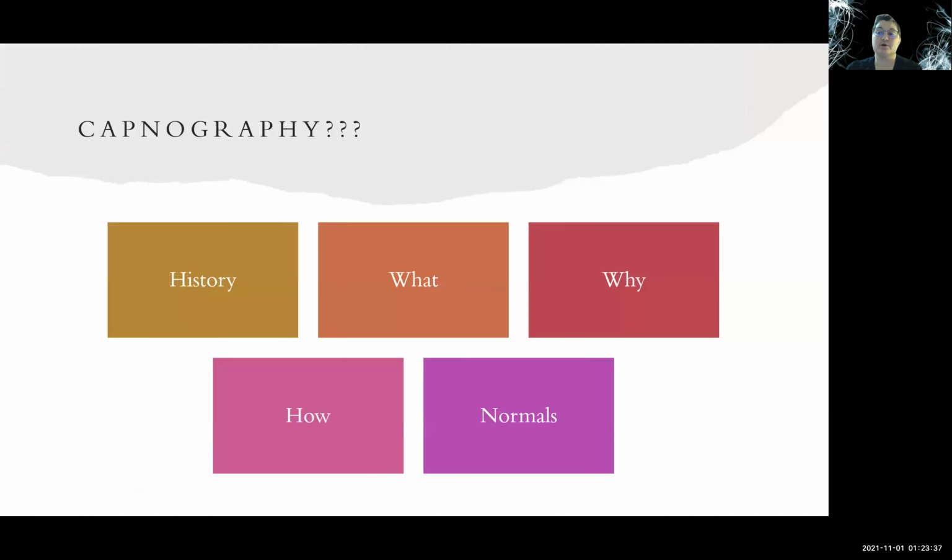Now, in 1943, a man named Karl Luft introduced the first infrared CO2 measuring and recording device. Ultimately, there are 5 physical methods of measuring end tidal CO2, and even a chemical one. But the infrared method seems to be the least expensive and most compact. Now, the country of Holland, back in 1978, was the first country to adopt capnography as a standard of monitoring during anesthetic events.